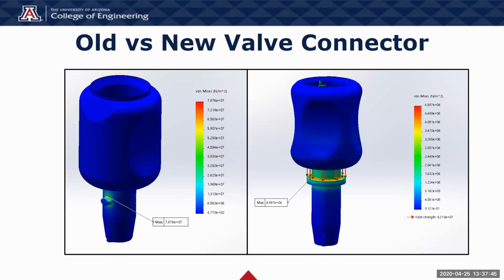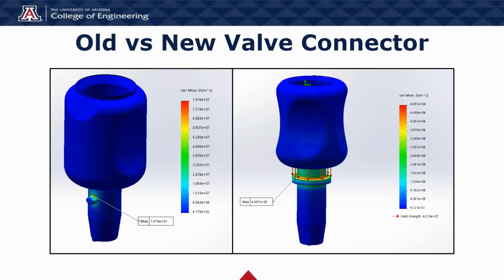This analysis showed us how much stronger our new valve connector is predicted to be than the old tap design. The maximum stress in the new valve connector is 16 times less than in the old connector. The new design's ring spreads force over a much greater area.